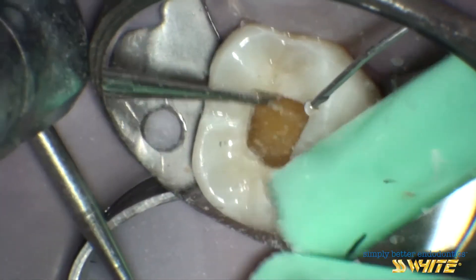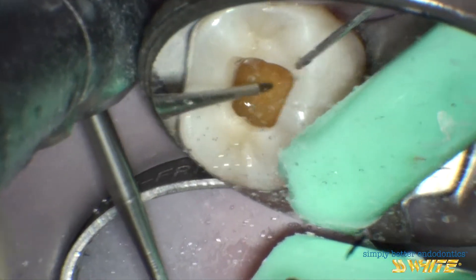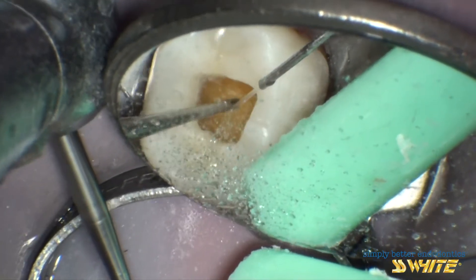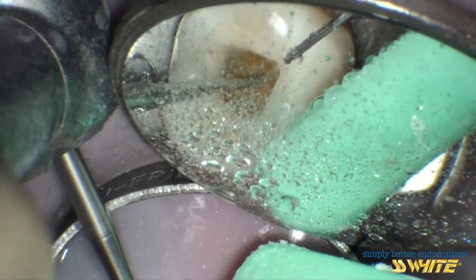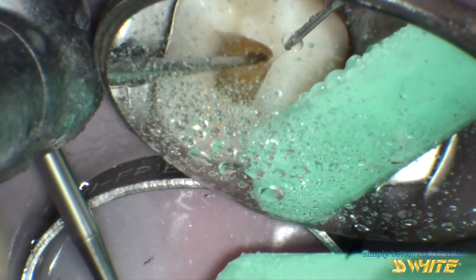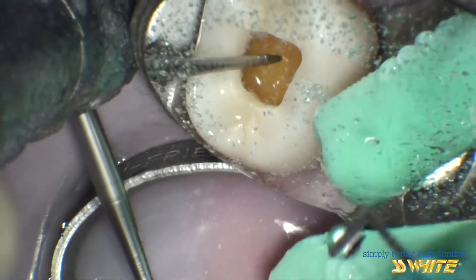This is the initial step into the dentin. Now the EG1A, or the Endoguide Burr, will be used to make conservative access into the pulp chamber. With the Endoguide, we have clear visibility and better tactile feedback when mapping. It's fast, with no run out as you might find with a round burr.